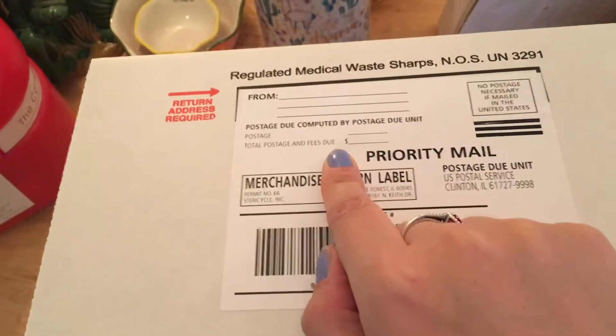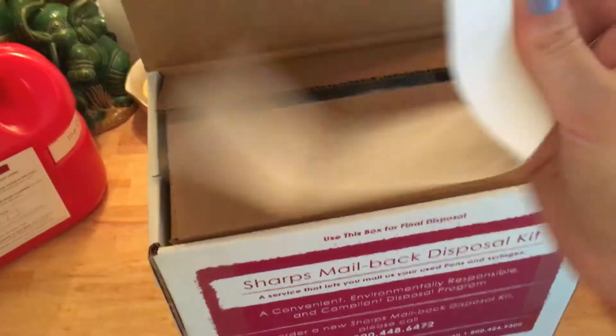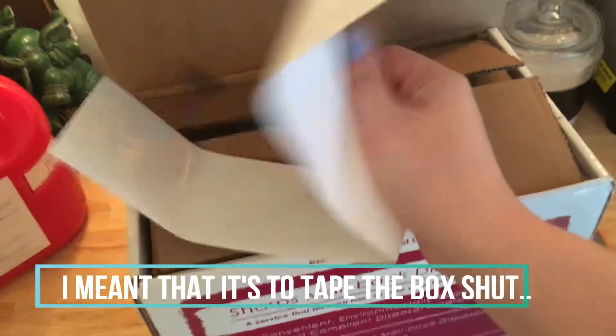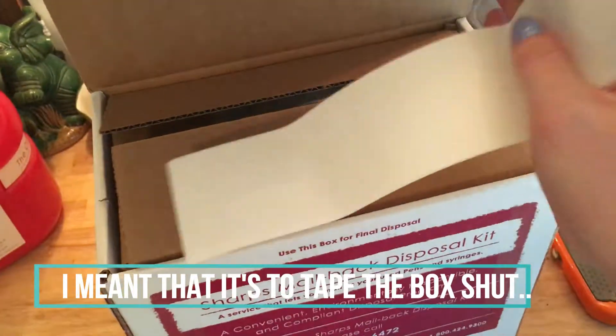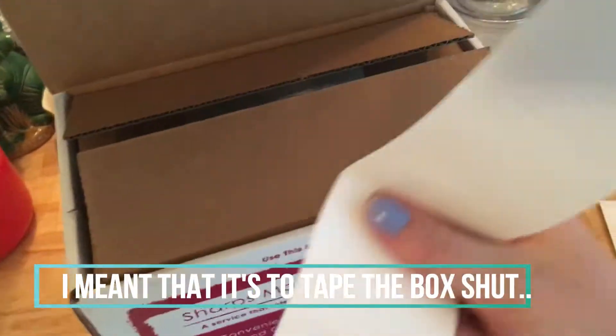You will not have to pay any postage — this is completely free. This is what you seal and give to your post office. These are really important: the first time I did this I threw them away. This is actually a very sticky adhesive that you're going to need to secure a plastic bag around the sharps container, so don't throw this away. Keep that.